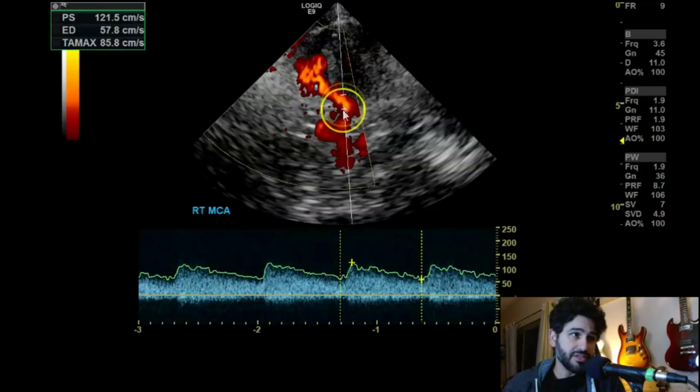So more medially towards the midline. Here you see the MCA starts to go into the anterior cerebral artery. So I usually take about there. If you go too low, you'll start to get a lot of reversal flow because you're getting both MCA and ACA.